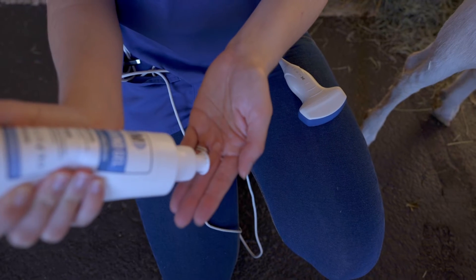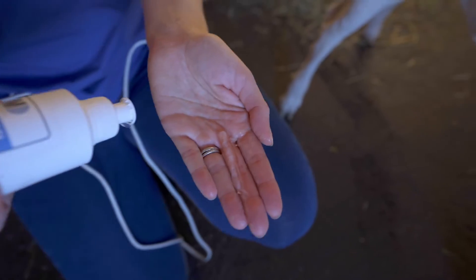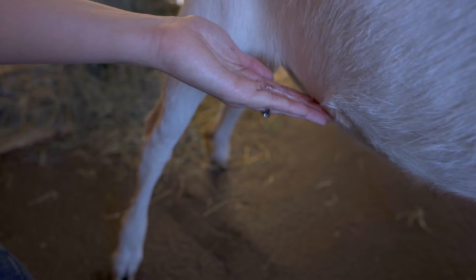To scan a goat you need to first apply gel to eliminate air. You can put this on your hand and onto the underside of the goat, or you can put it directly onto your probe, or both.